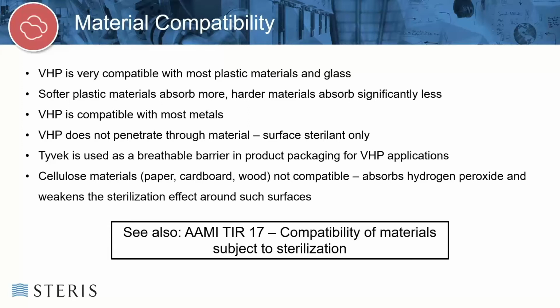So if you're looking for more information around material compatibility, AAMI TIR17 is actually a technical information report that looks at the compatibility of materials subject to sterilization with a range of different modalities, and this does have a section dedicated to hydrogen peroxide.